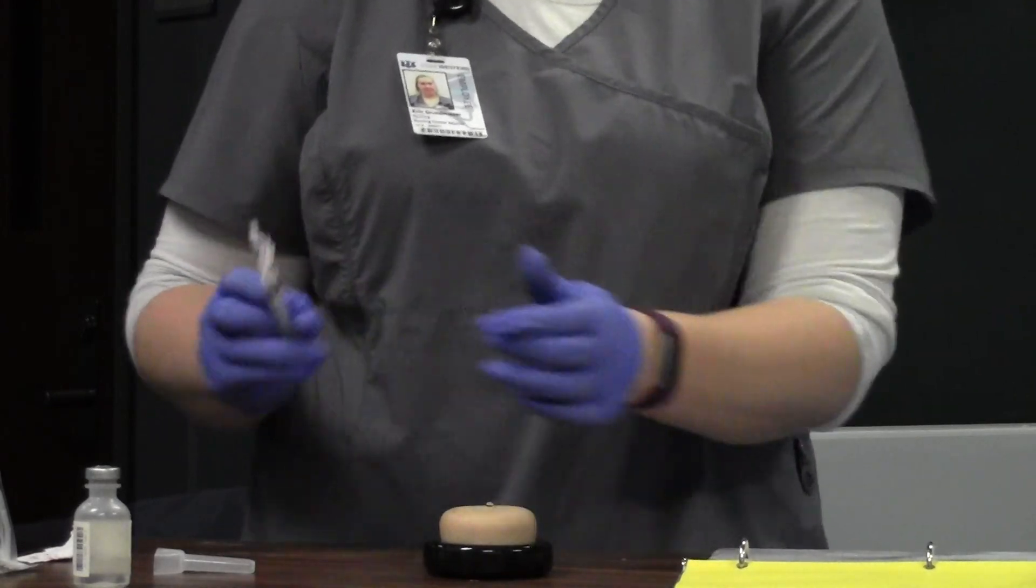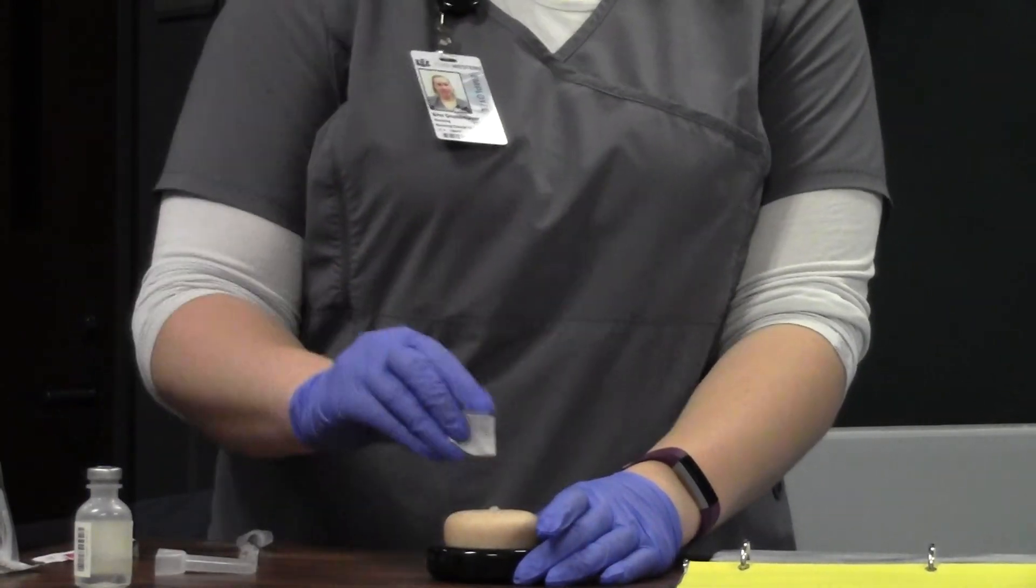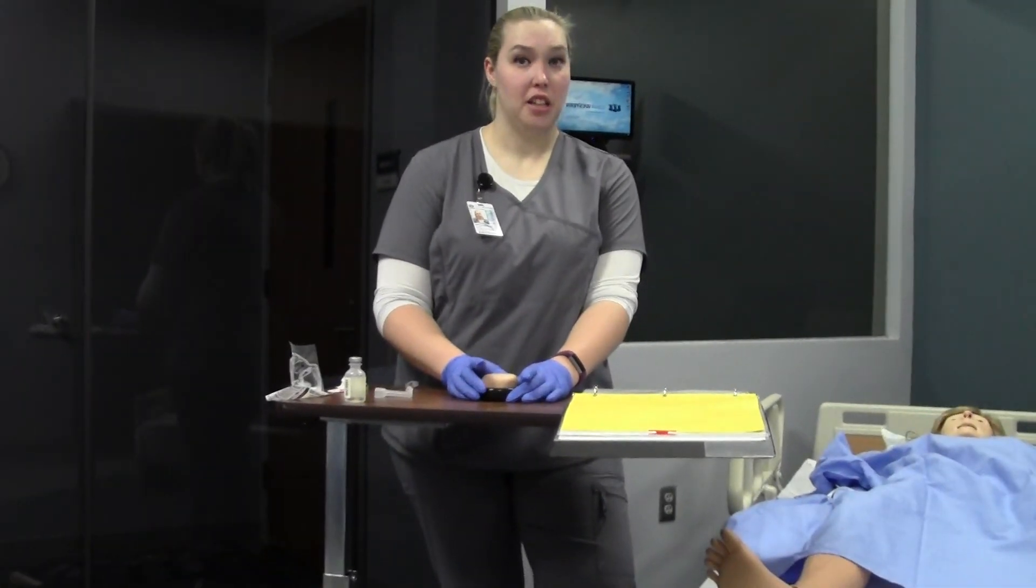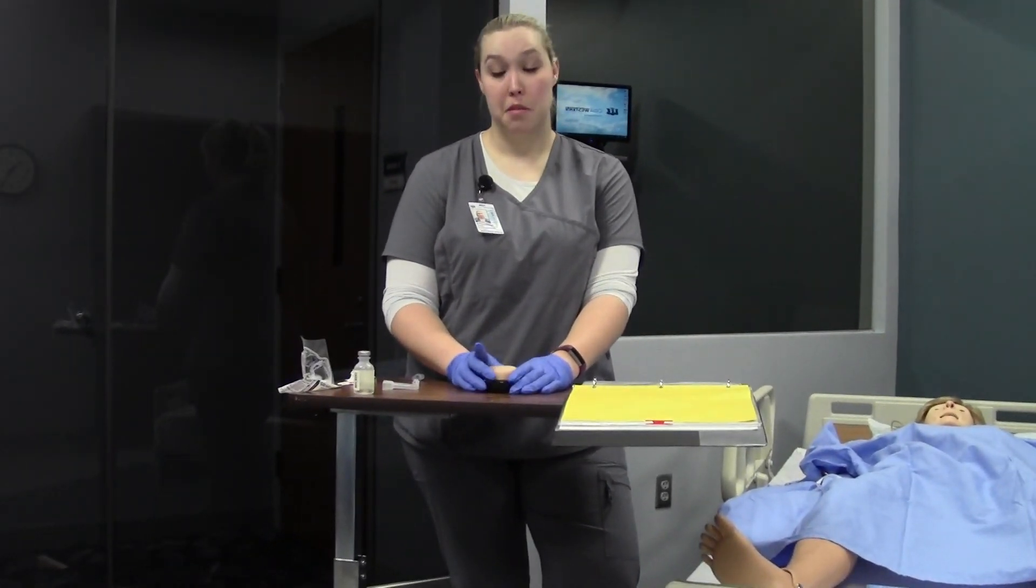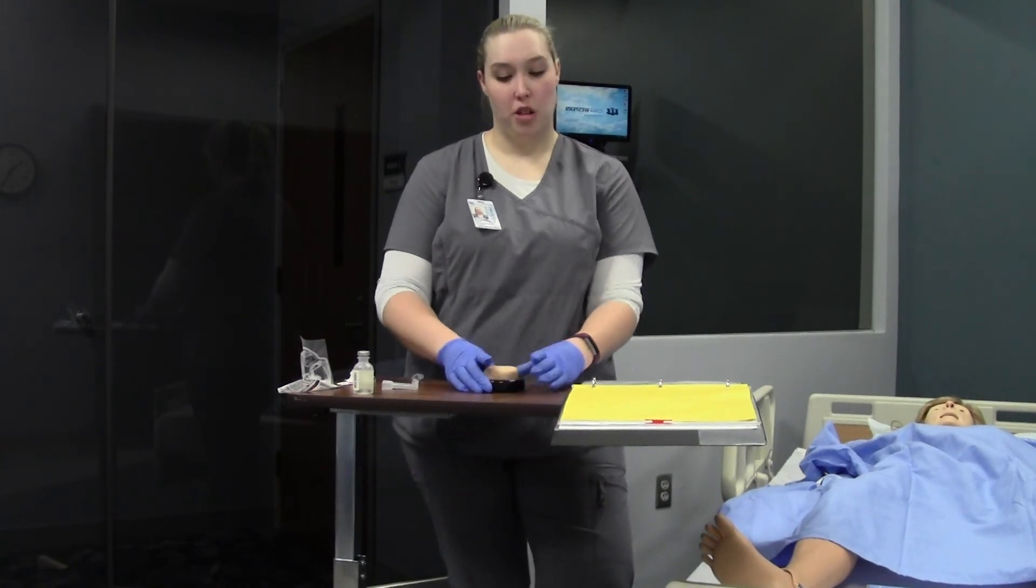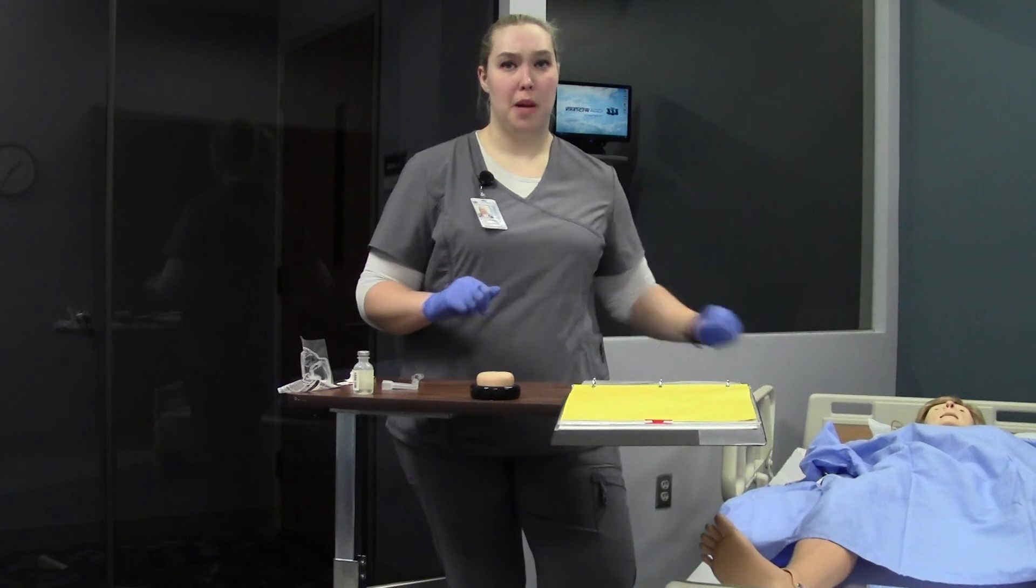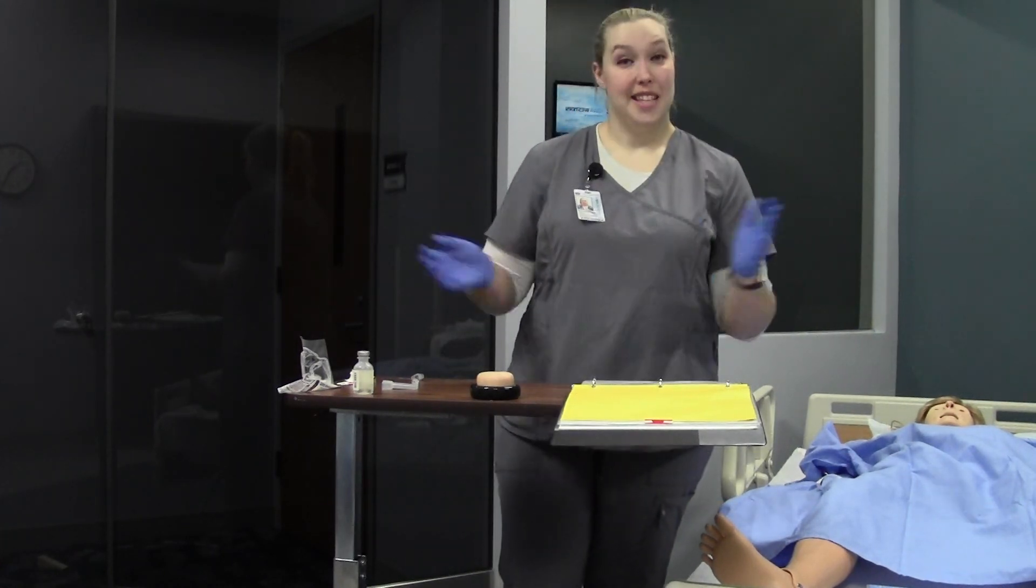I'm going to remove and activate my safety. I'm going to blot the extra, and for heparin, since it tends to bleed a little bit, you can put a Band-Aid over the top, just as a precaution. That way, they don't have any blood marks or blood spots on their gown. That's it.